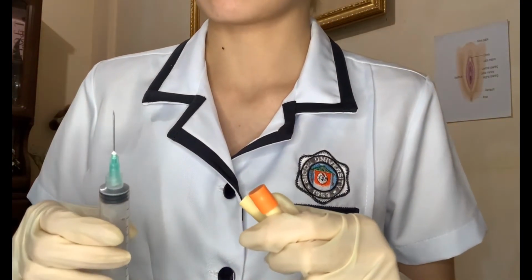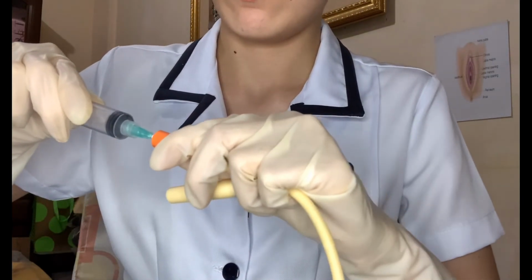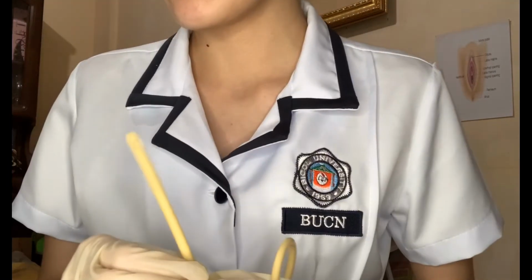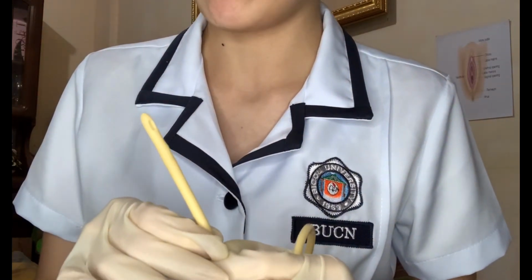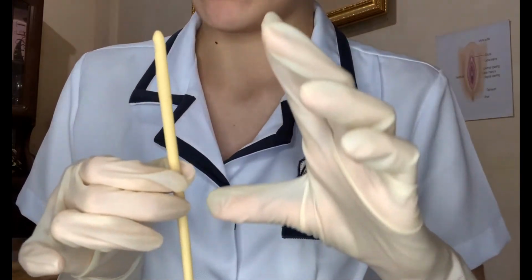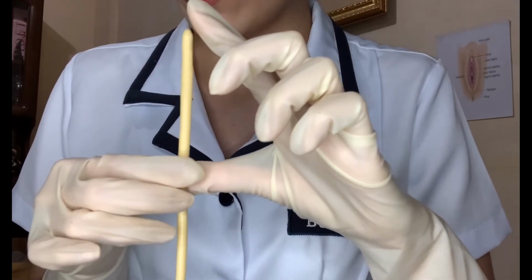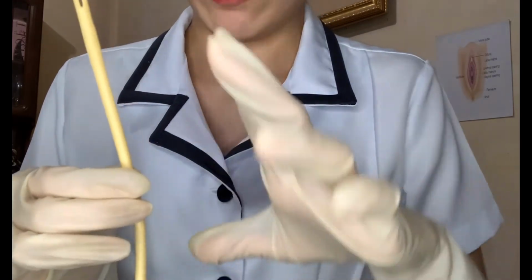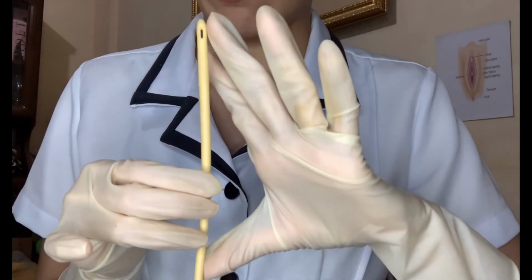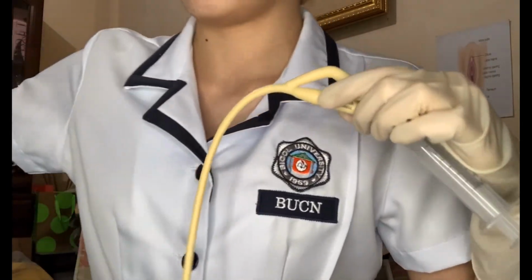And now we will attach the pre-filled syringe to the indwelling catheter inflation hub. And now we will lubricate the catheter. For females, we have 2.5 to 5 centimeters, which is approximately 1 to 2 inches. And for males, 15 to 17.5 centimeters, which is 6 to 7 inches. So it's around this. And we will place it with the drainage end inside the collection container.